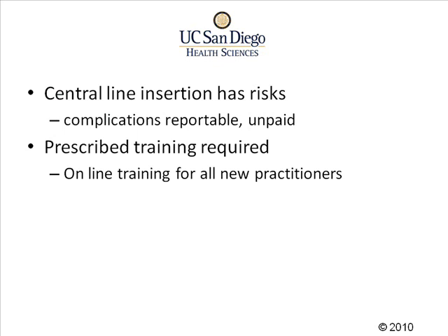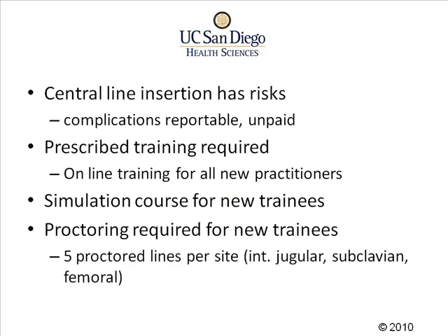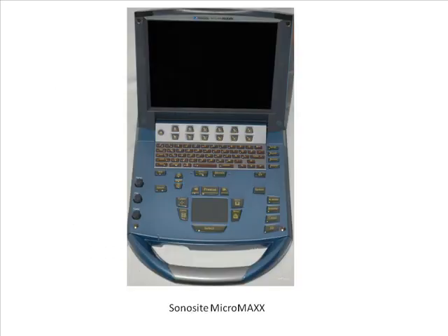Training is required for all new practitioners, including this online course and a simulation course for new trainees. New trainees must also be proctored for 5 lines at each site before they can insert lines on their own. Ultrasound is required for all routine central line insertions except in emergencies.